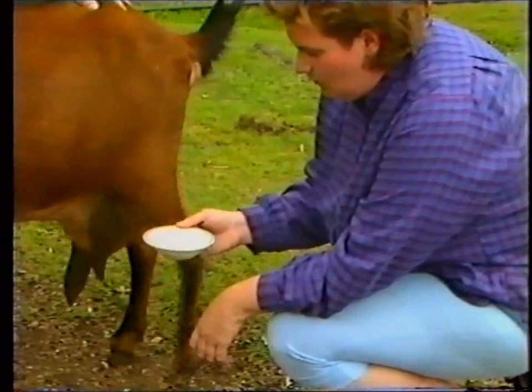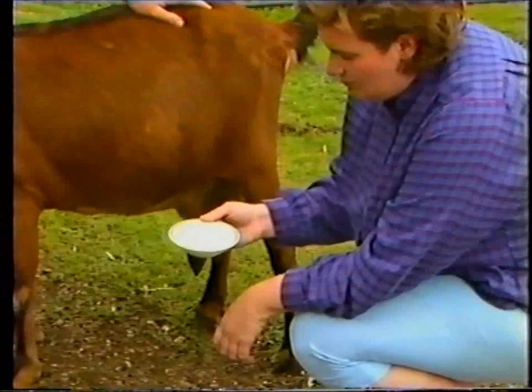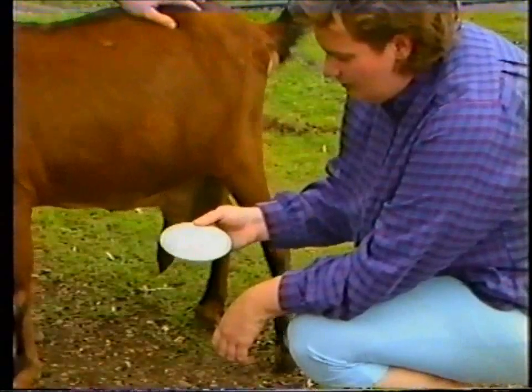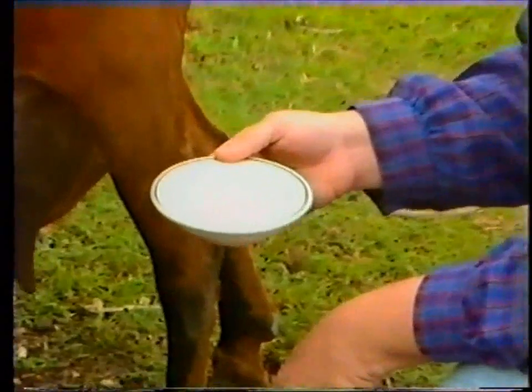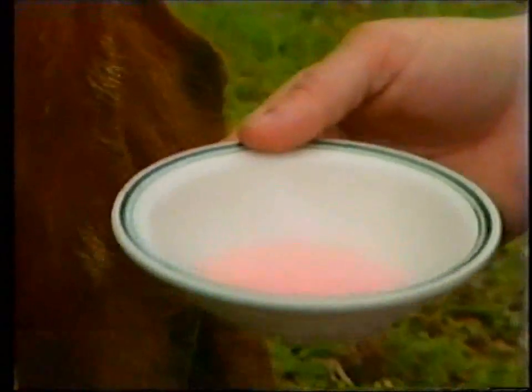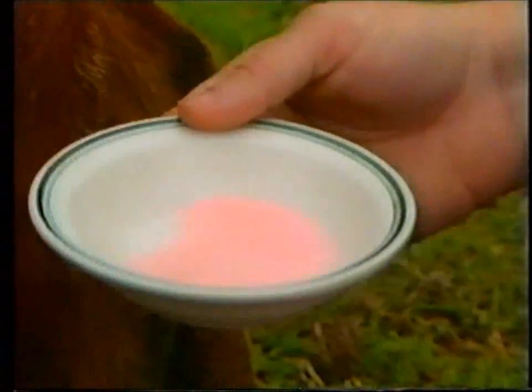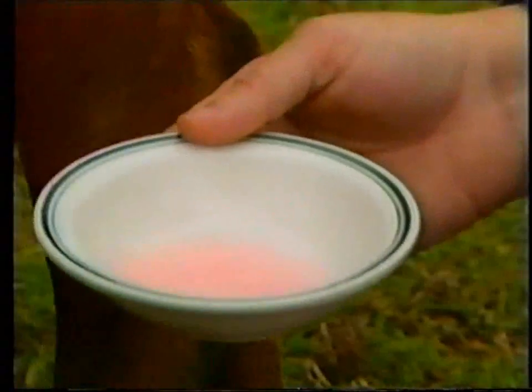If a gel forms, it indicates that mastitis may be present. In this case, you'll notice that the mixture is becoming thicker and thicker, and it is starting to cling to the bottom of the porcelain container. This indicates a positive reaction and mastitis may be present. Notice it's becoming jelly-like in consistency.